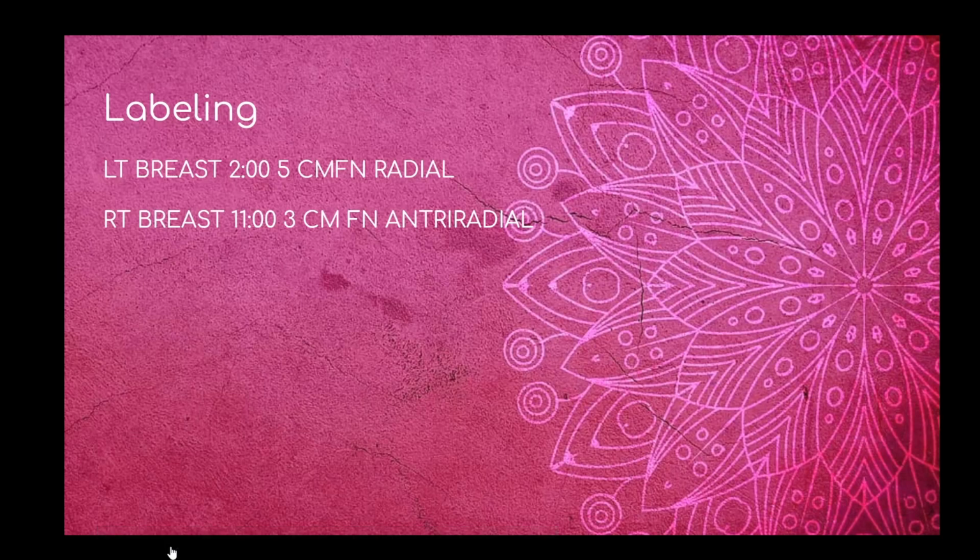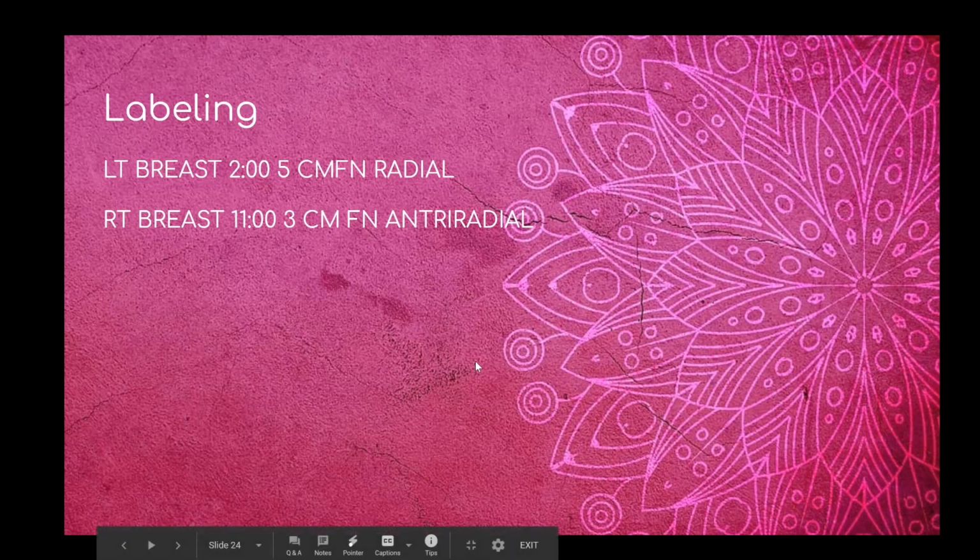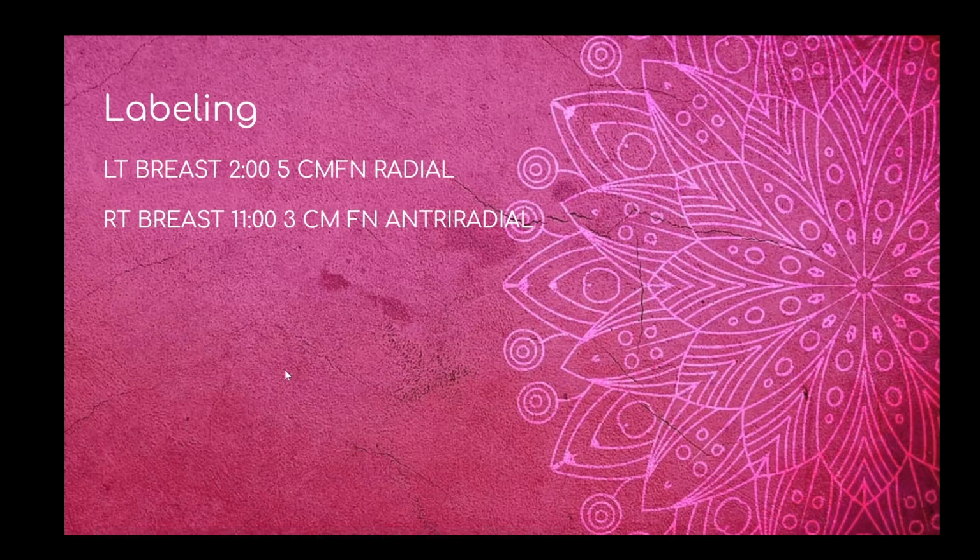So then our final full complete labeling that I expect on your images will be left breast or right breast, a clock position, how many centimeters from the nipple, and then radial or anti-radial. And we're actually going to go one step further in our labeling, and add in the quadrant that you're in, just because I want you to practice recognizing quadrants and clock position.